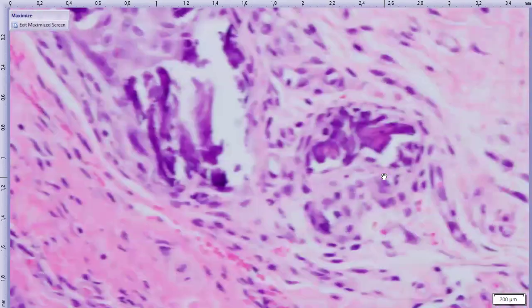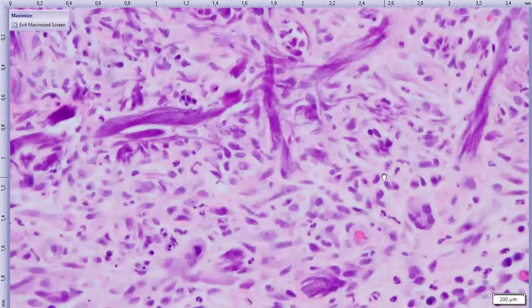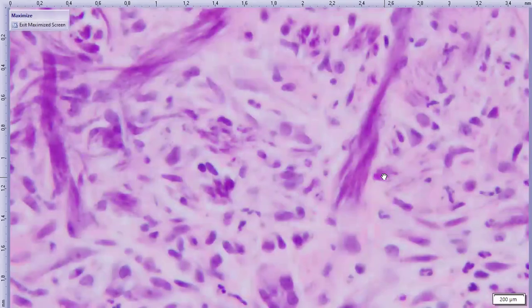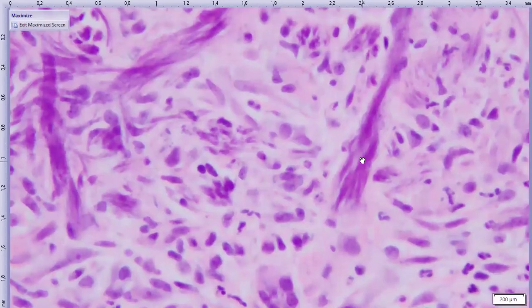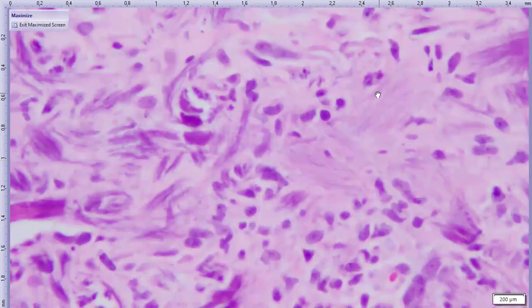The other morphology of the mineral is more common than that, I thought. It's this much more finely fibrillar mineral pattern here. So I almost wondered if this was mineralization of the collagen of the substantia propria. Here's a nice example where it's really finely fibrillar. So it's probably some sort of dystrophic mineralization, I think.